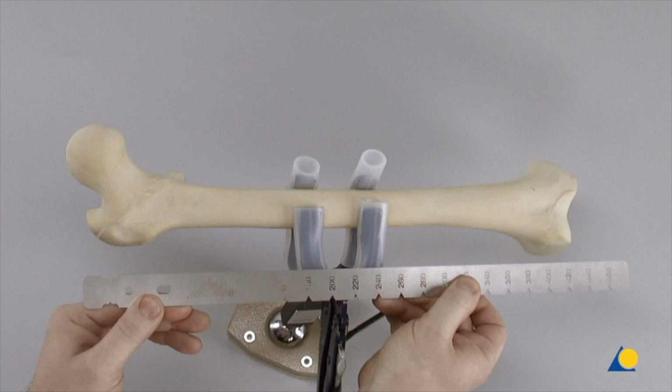However, it is unsterile. It is recommended to treat all fractures with the longest nail possible, taking into account patient anatomy or previous implants. Dynamization must be taken into account when determining nail length. The dynamic locking option allows 5 mm of travel, therefore a shorter nail should be chosen.